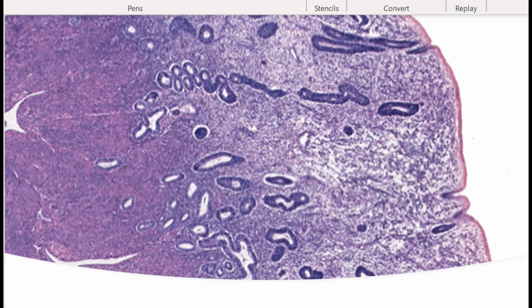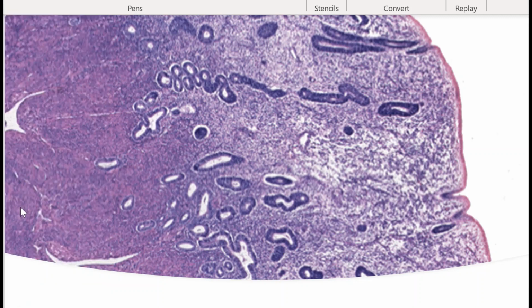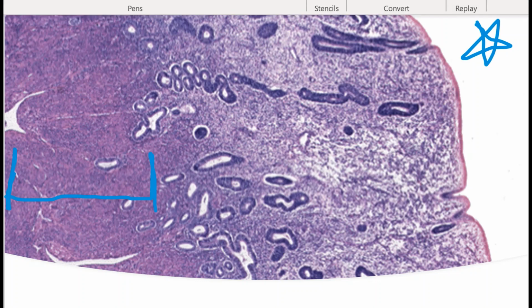First thing that we're going to find is the myometrium, which is going to be all this goodness here. If you're finding your apical surface, this is going to be the area furthest away. So the darker, and to me it's always a very dark region, pretty much. And it's huge. It's huge.